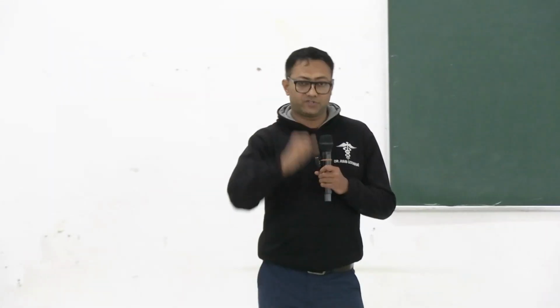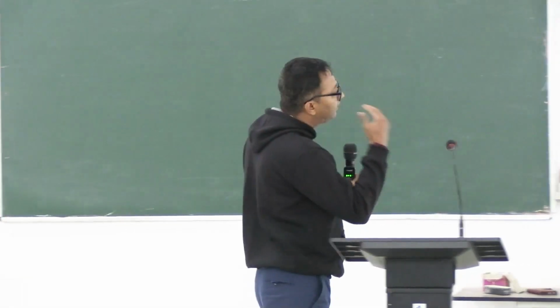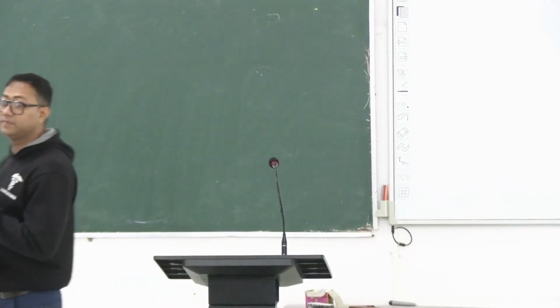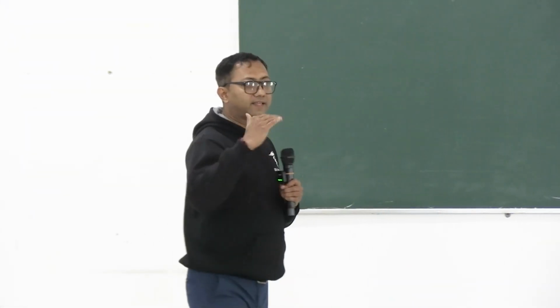Now, in acute coronary syndrome, depending on the diagnosis, the ST segment might be elevated or depressed, so that there will be a net voltage during the ST segment.